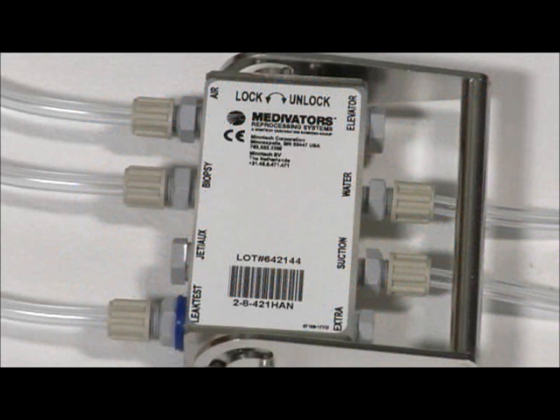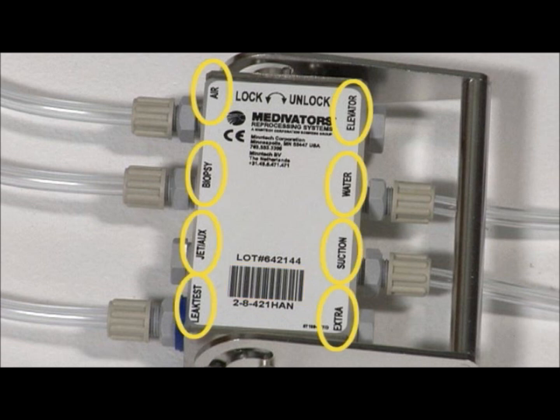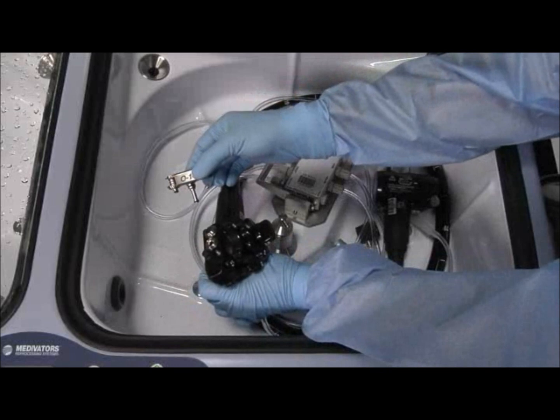Hookup connector blocks are labeled with hookup part number, barcode, and individual channels. The hookups also include a channel separator.